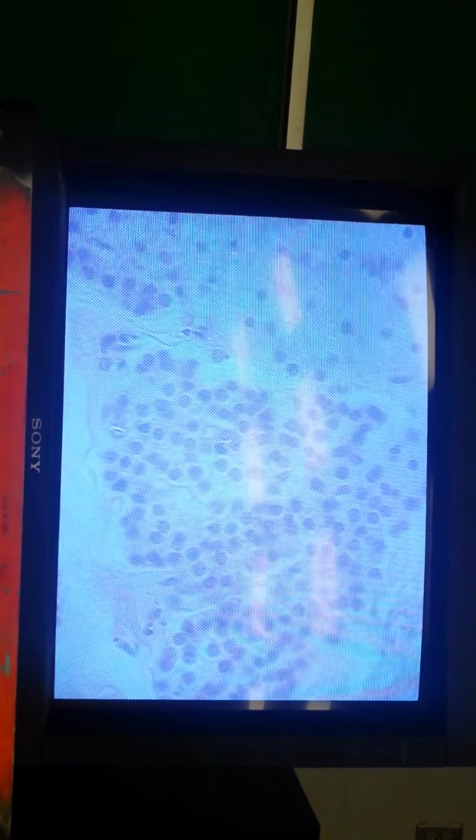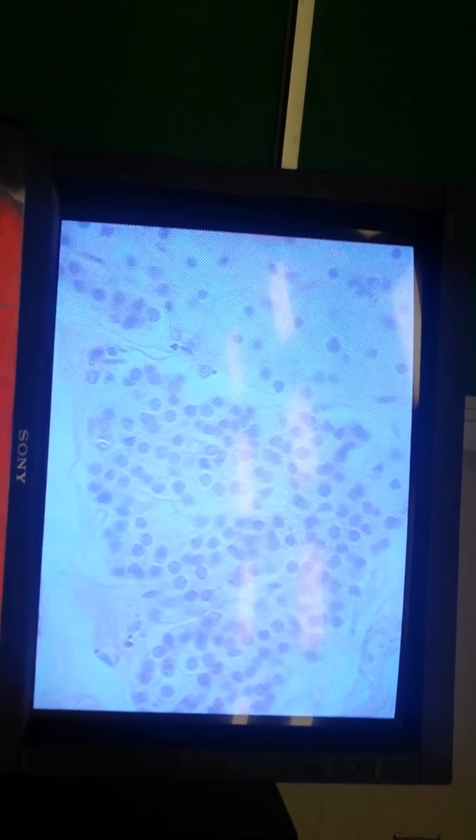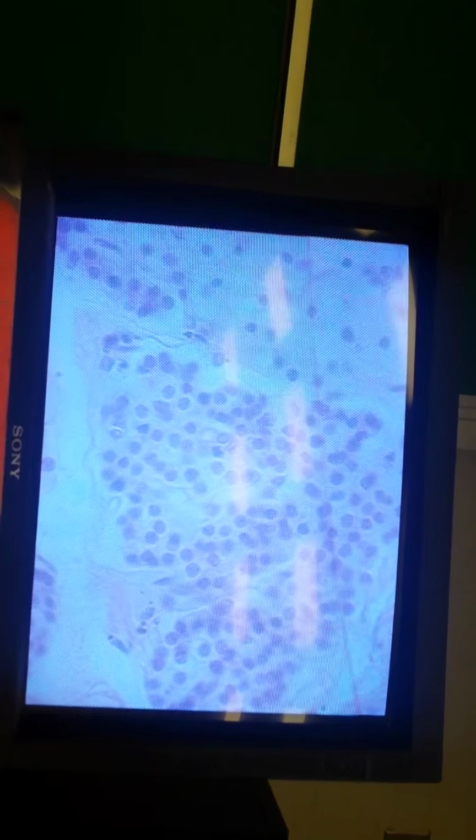And what do they secrete? PTH. Okay. And what are these cells? Oxyphil. Oxyphil cells. And what do they do? Well, maybe they do. If you know, publish. Because, okay, no, we don't know what they do. We're not sure. Okay.